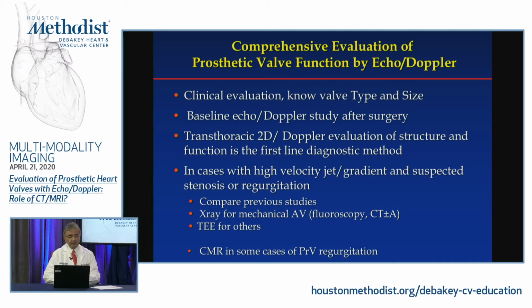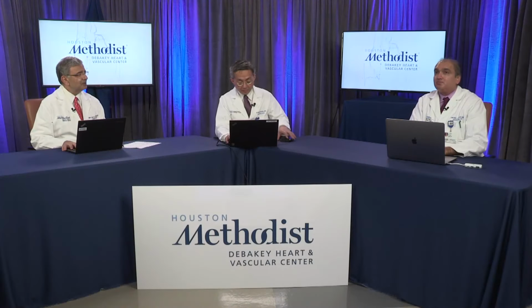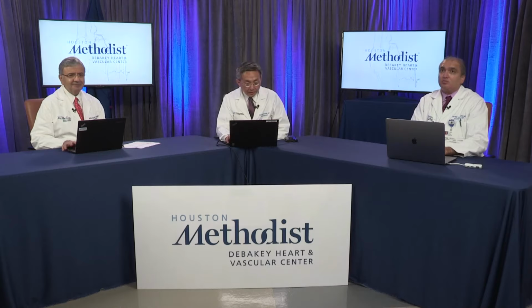So I'm going to introduce Dr. Sumin Chang here, who will guide us through some of the evaluations of prosthetic valves using CT. Sumin? Thank you, Dr. Zoghbi.